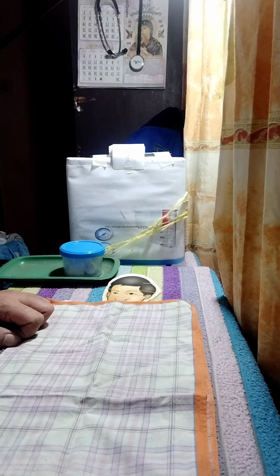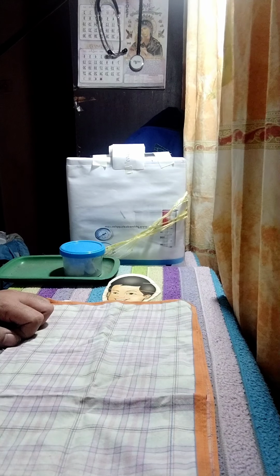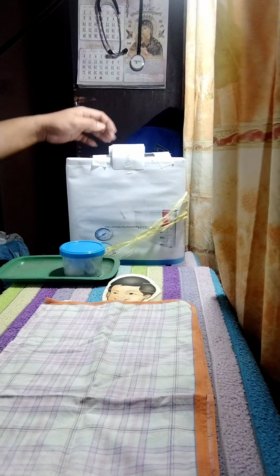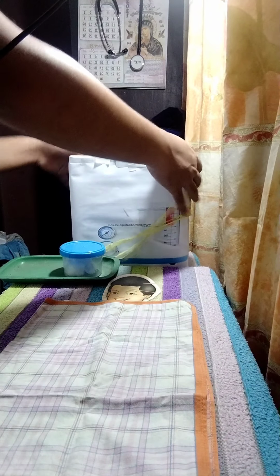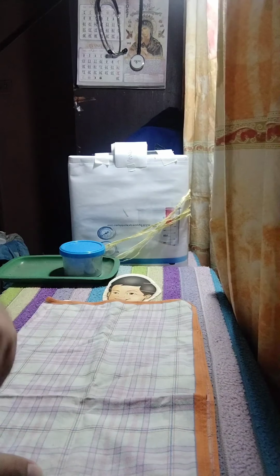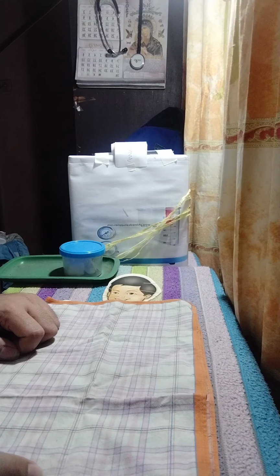Next, place the ECG machine close to the patient's bed and plug the power cord into the wall. Next, if the bed is adjustable, raise it to a comfortable working position.